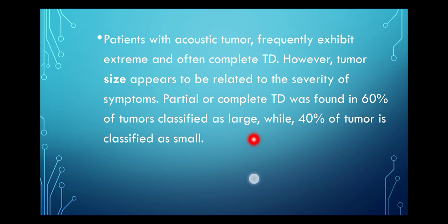In the tone decay test, when the sound presented is not heard for 60 seconds, it is incrementally increased by 5 decibels until the patient hears for a full 60 seconds. If the patient can hear only after increasing to 25 plus decibels, then the pathology is construed to be retrocochlear. A comprehensive discussion about the tone decay test.